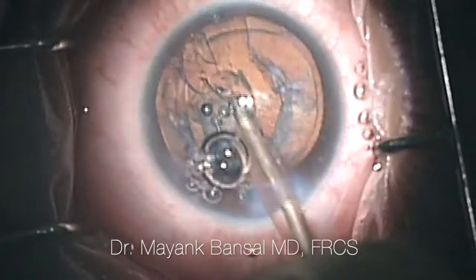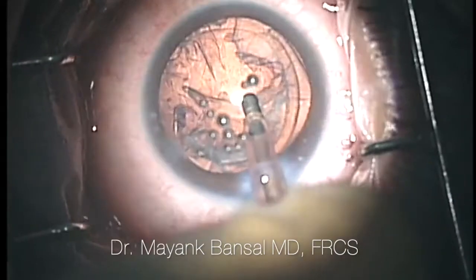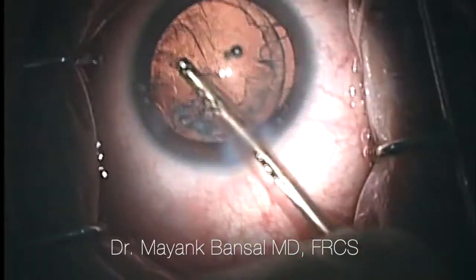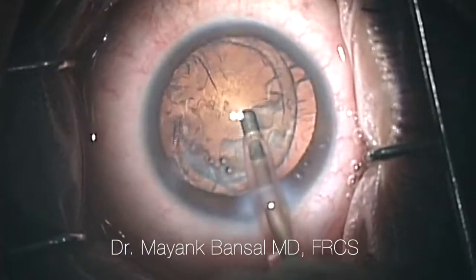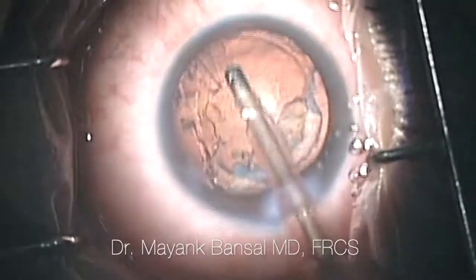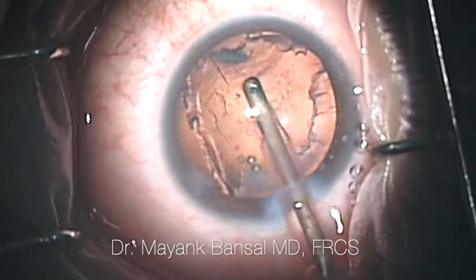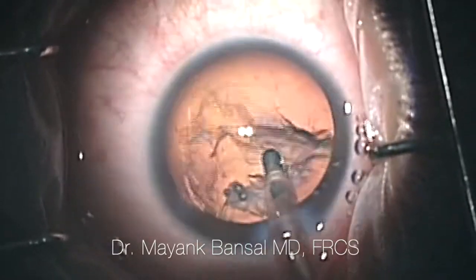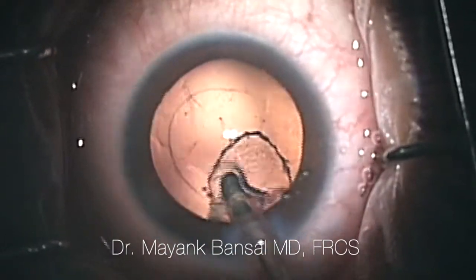Now it's important at this stage to be very careful not to aspirate parts of the capsular bag — it's most bare at this stage. If we do cause a nick or an opening, then there's a chance of the lens material going posteriorly into the retina or the fundus. As a retina surgeon, we are able to take care of that, but it's something that's best avoided.